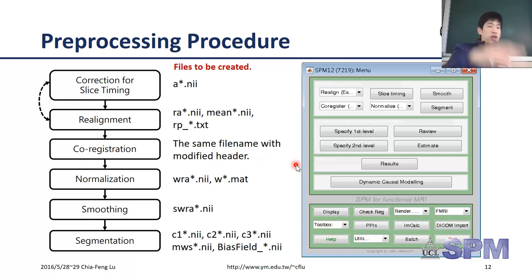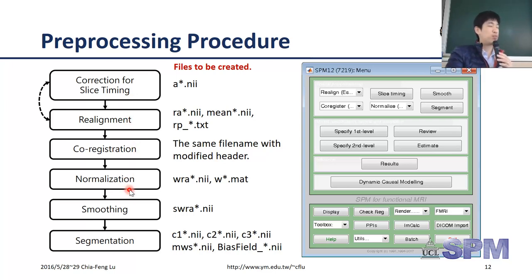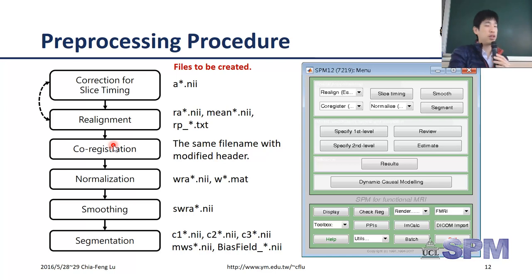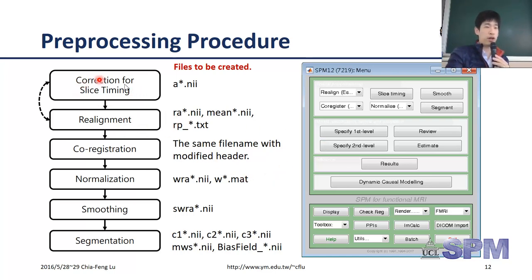For the full pre-processing procedure you can see there are many different steps. If you want to do it in a simple way, you can use the batch process. In the very first step we will do the correction for slice timing - I'll explain why we need each of these steps after going through the whole procedure.